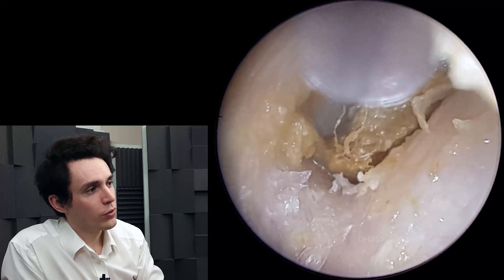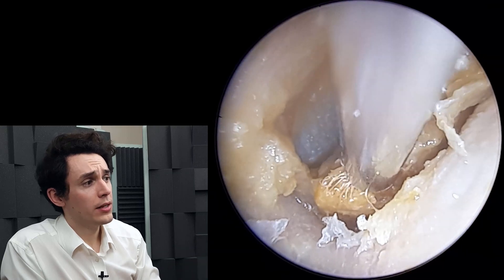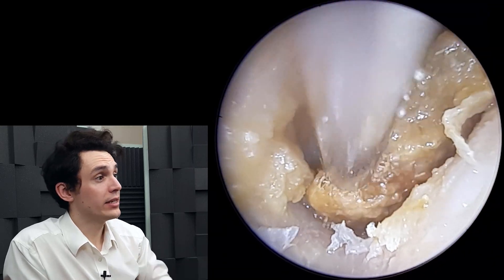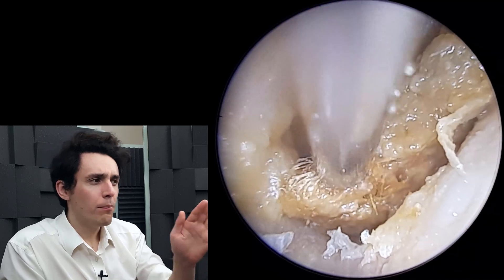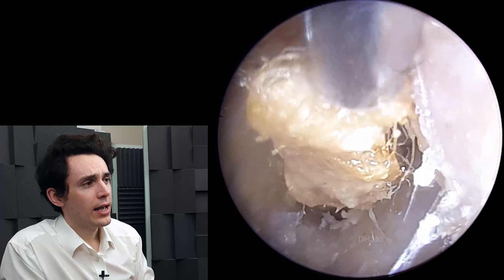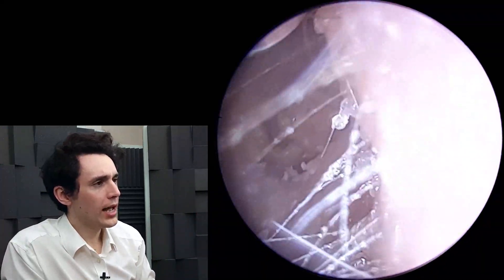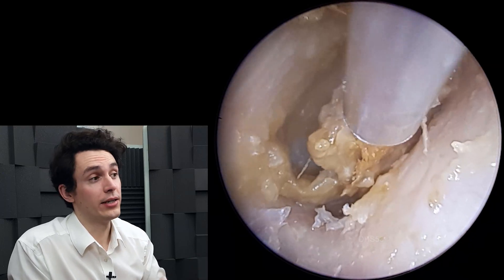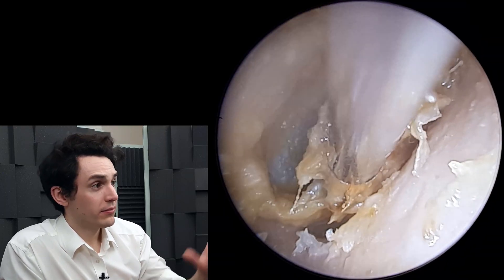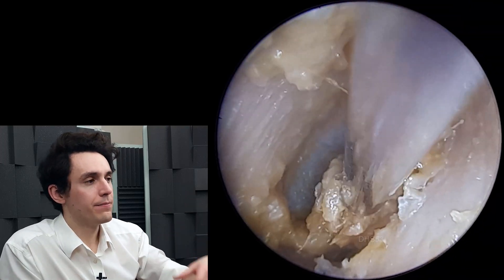But here we're in some luck, so what we're going to do is remove all of this wax from this recess. This is the anterior recess, so it's like a pocket or a trench just before the eardrum, just on the right-hand side. And we're going to slowly work our way through this wax and restore the patient's hearing. You can see there's actually quite a colossal amount of wax that we're just breaking apart bit by bit.